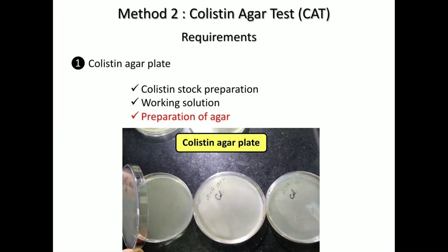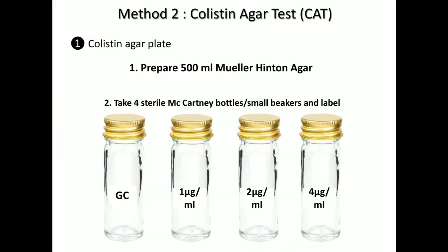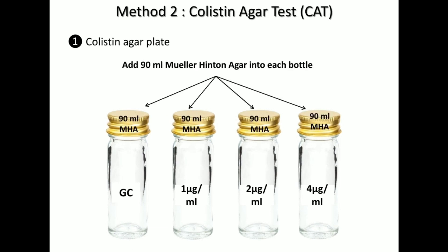After this we are ready to prepare the colistin agar plates. First, prepare 500 ml of Mueller-Hinton agar, then take 4 sterile McCartney bottles or small beakers and label them accordingly as growth control, 1 microgram, 2 microgram, and 4 microgram. Add 90 ml of Mueller-Hinton agar into each of the bottles.